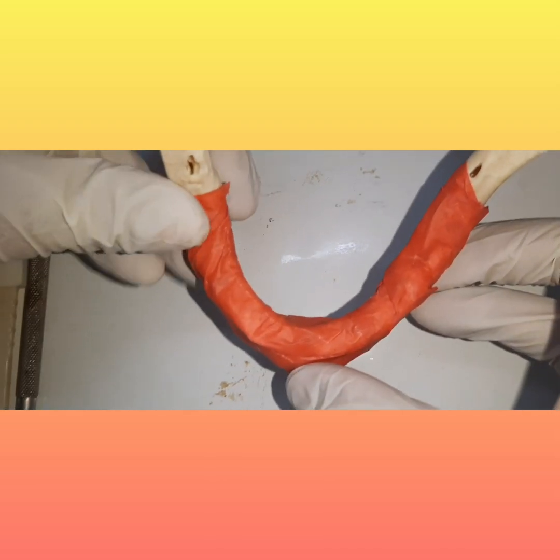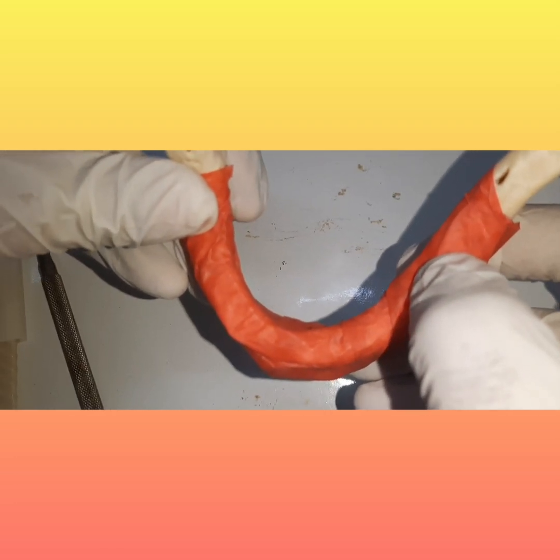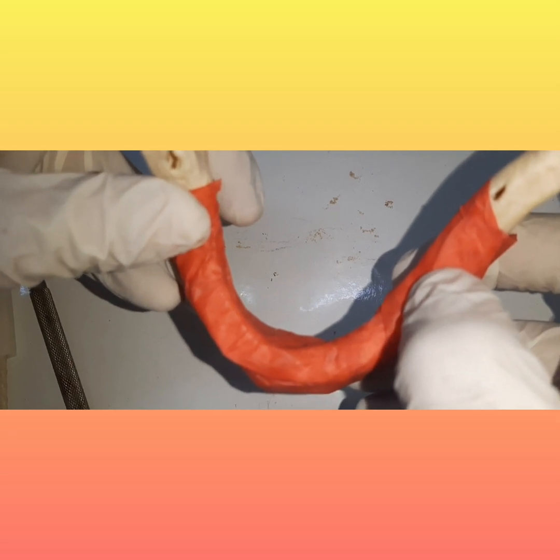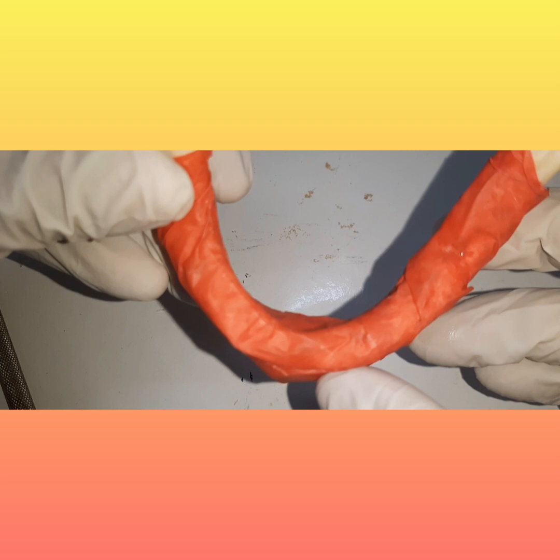So we have this edentulous model, and suppose I want to place an implant in this particular area, that is in the lower canine region. What we are going to do first is, you can use a surgical stent that will help you place the implant in the correct direction and orient the implant properly. But if you are not having that, you have to reflect the flap. It can be done in two ways. Either you can do a flapless procedure or you can reflect the flap. So here I will tell you how to reflect the flap.